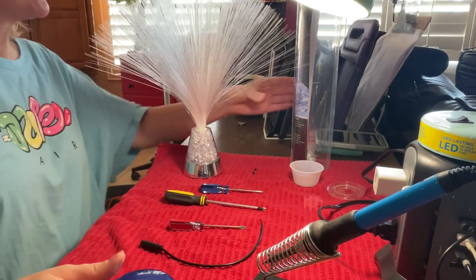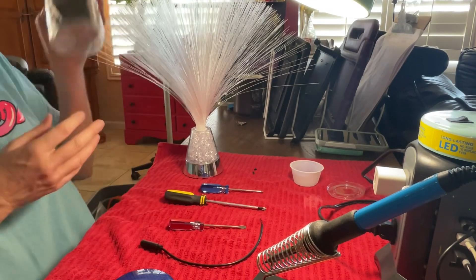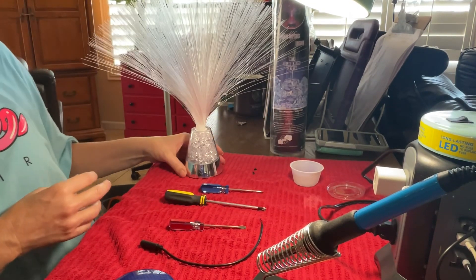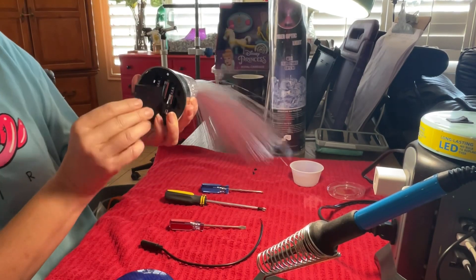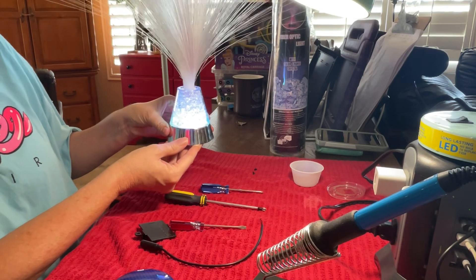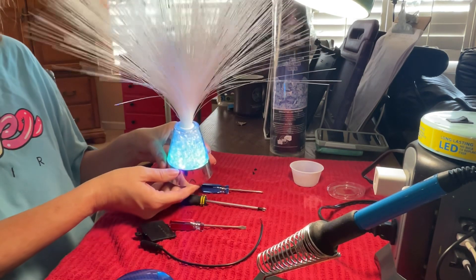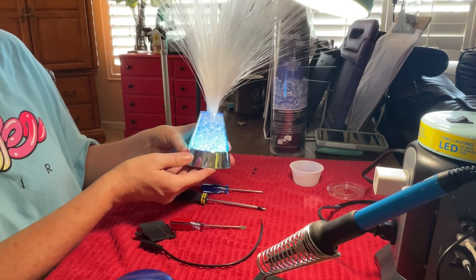Today we're going to switch adapt this fiber optic light. I got this on Amazon — it was about $12. The first thing I do is test it to make sure that it works. I put batteries in it, tested it, turned it on, and it works beautifully. That's the very first thing you want to do, to make sure you aren't trying to switch adapt something that doesn't work.